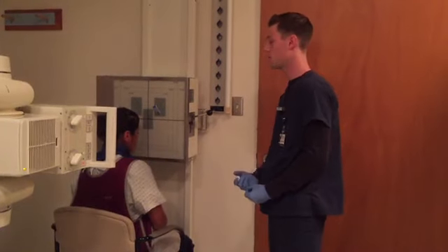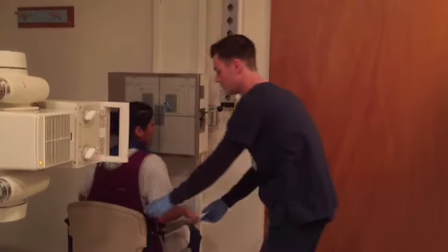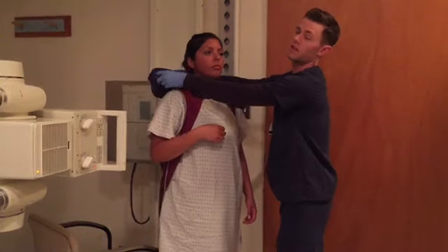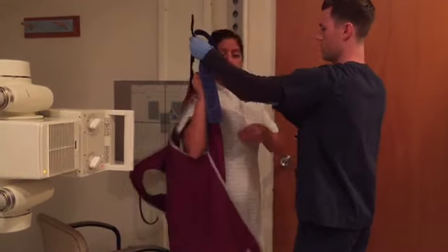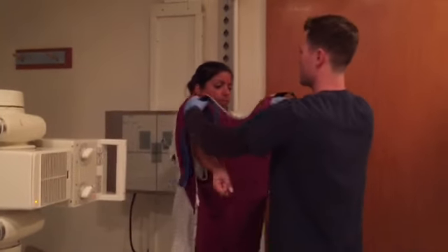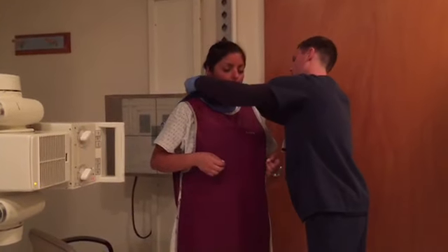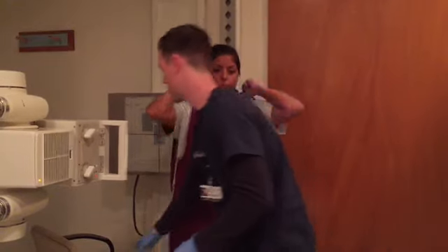Alright, and the next view we're going to do is the SMV. We're actually going to have her stand up now. It's going to be kind of an AP projection. So what we're going to do is remove the shielding and move it around to the front. For this one, the mid-sagittal plane is going to be perpendicular to the IR again. And we're going to rotate the chair around.